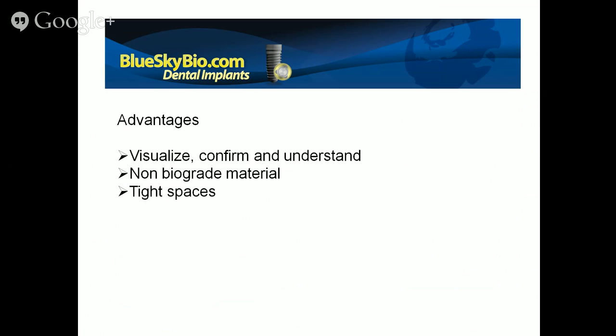The second reason, which is the most important reason, is that it could be done with a non-biograde material.